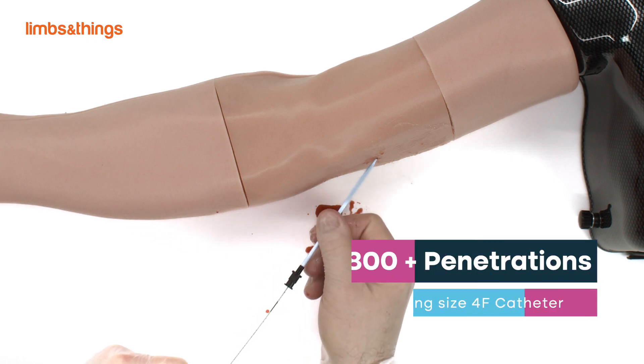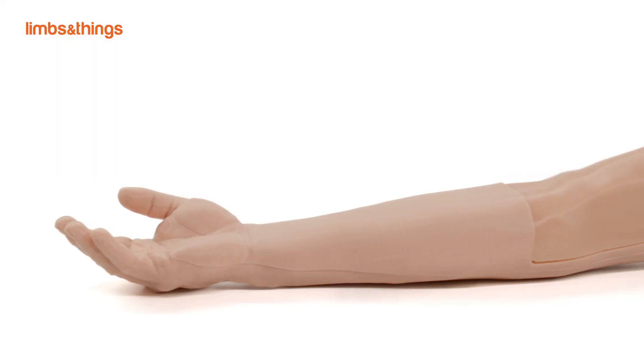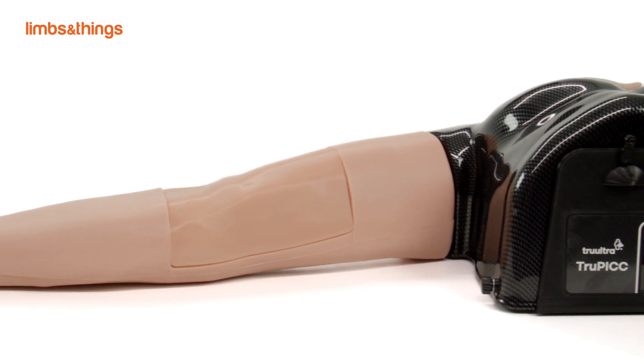TruPic can facilitate 800 plus needle penetrations using a size 4F catheter. All the parts are cost effective and can be replaced quickly when required. The initial setup time is less than 5 minutes.